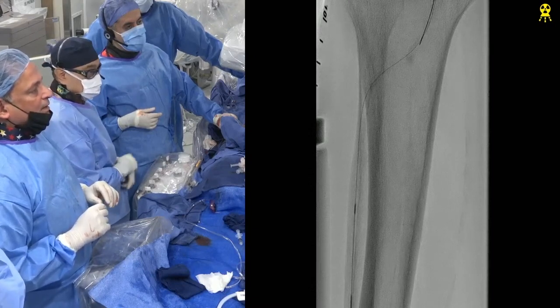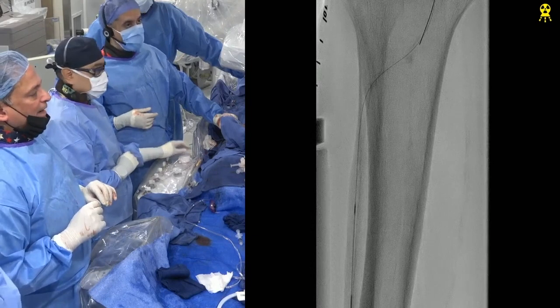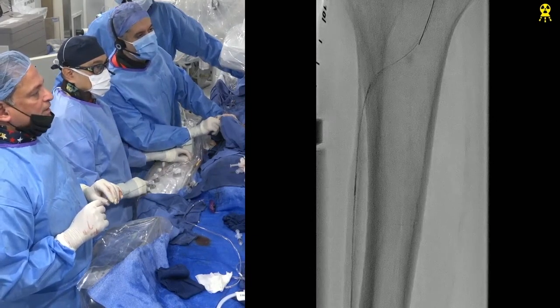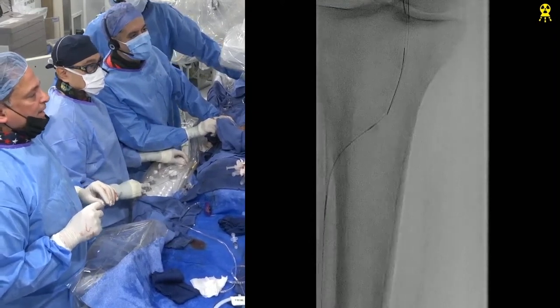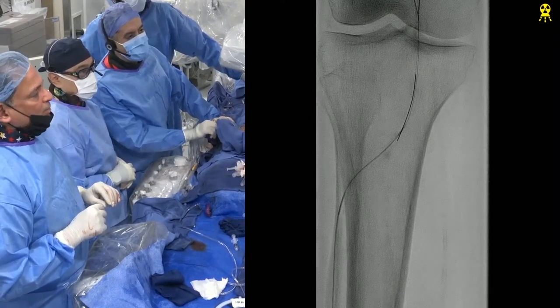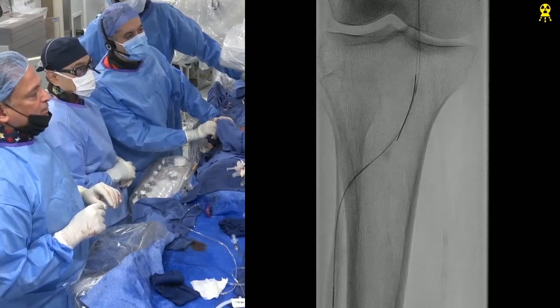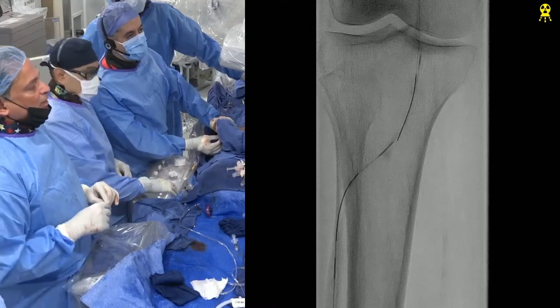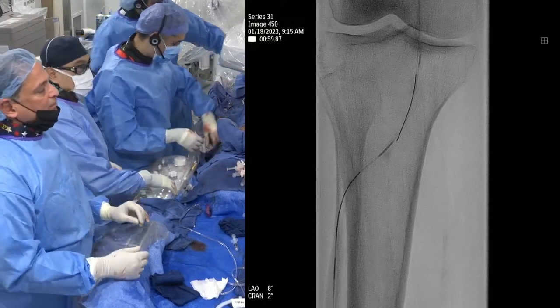There you go. Okay, now, Ray, track it up. So we're going to have to stent this. Track up the catheter, please. Yeah, I'm coming. So it's the same thing. Like, I don't know if you guys saw the subclavian case last month. A little higher, please, further up to the mid tibial tuberosity. It's the same thing. We track the sheath. Now you try to wire it.